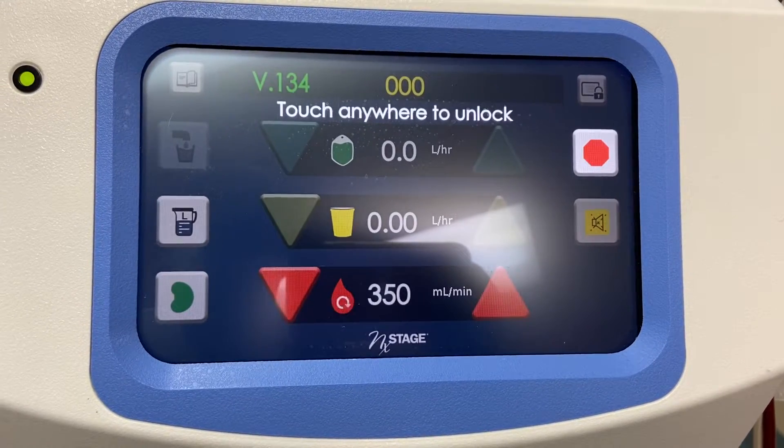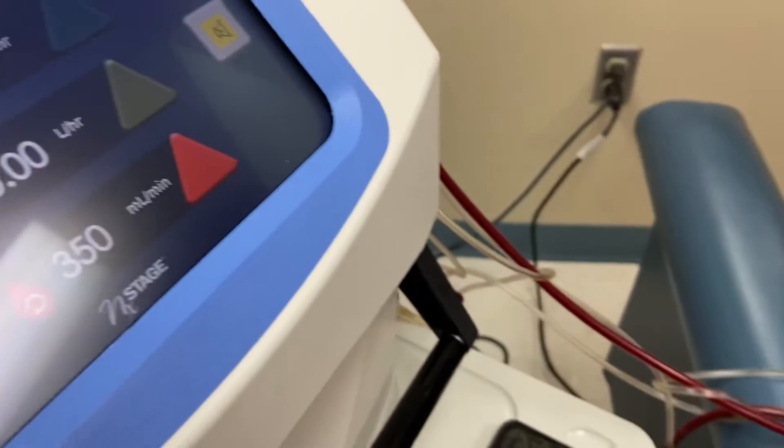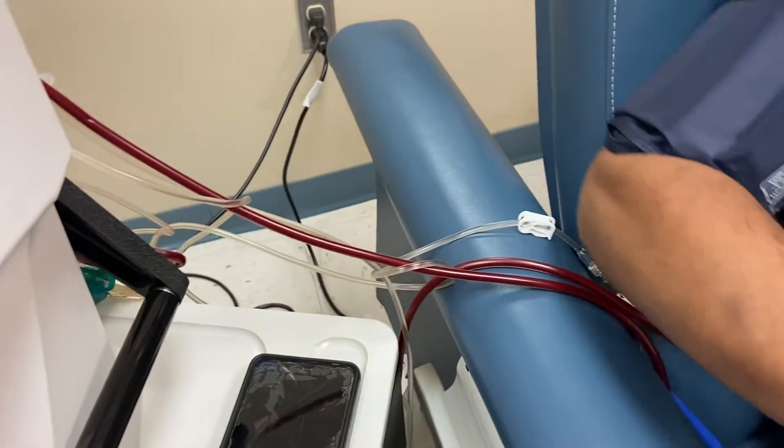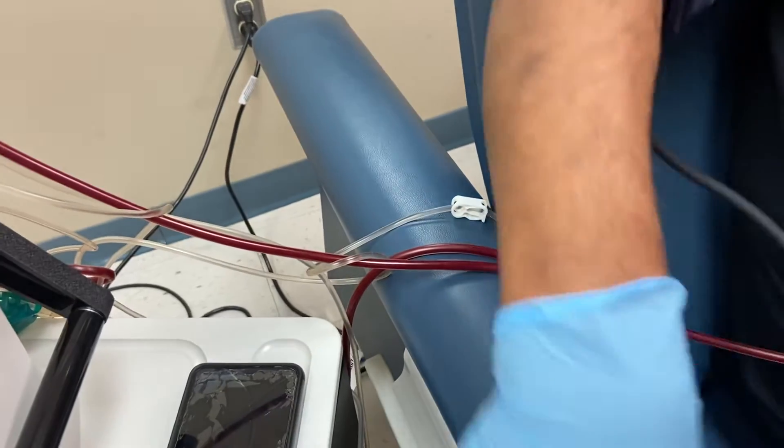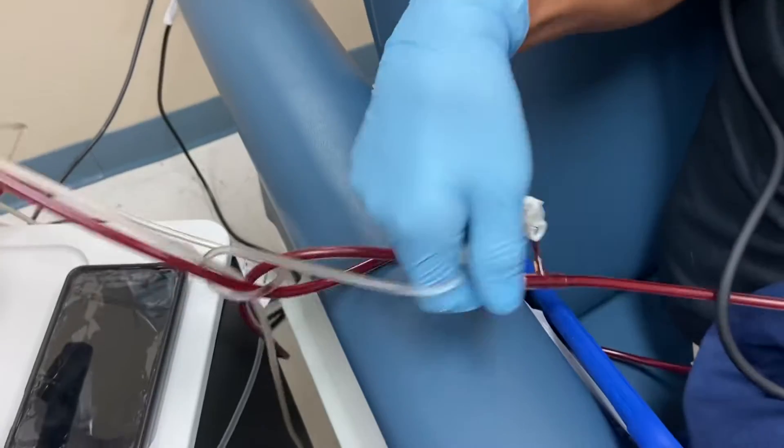So let's return the blood by closed technique. Get to the two white clamps, Joseph. Just prepare so it's accessible for you.